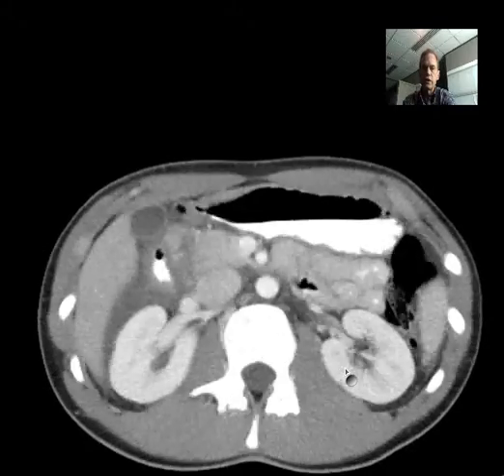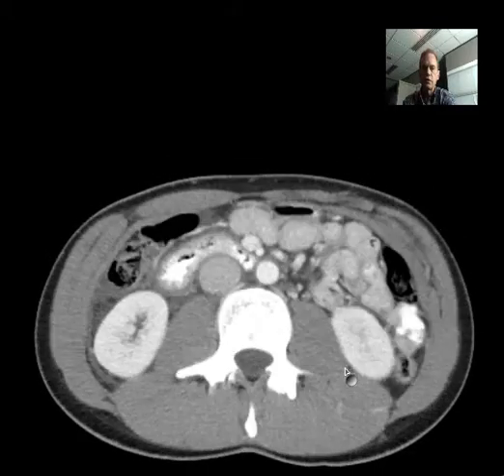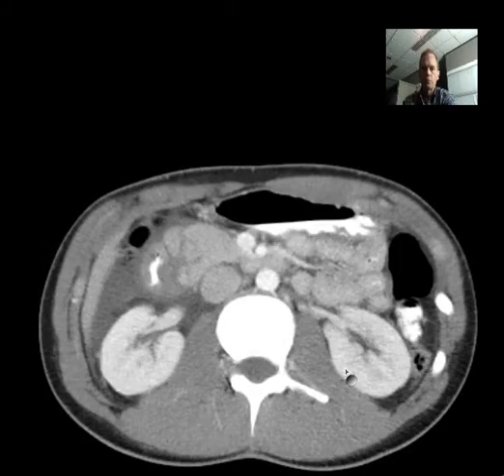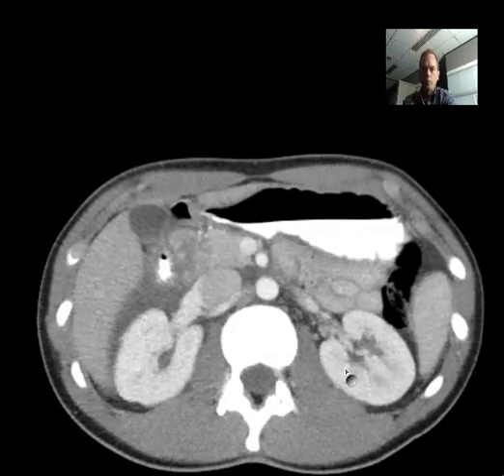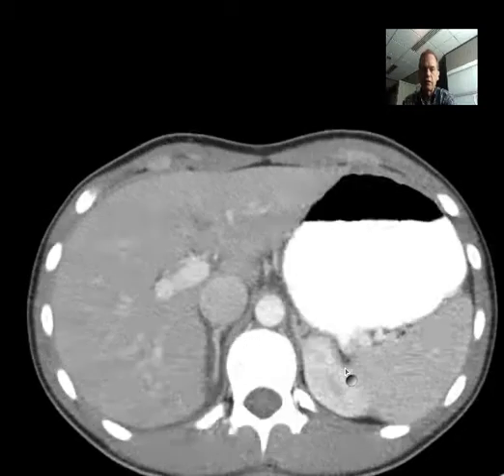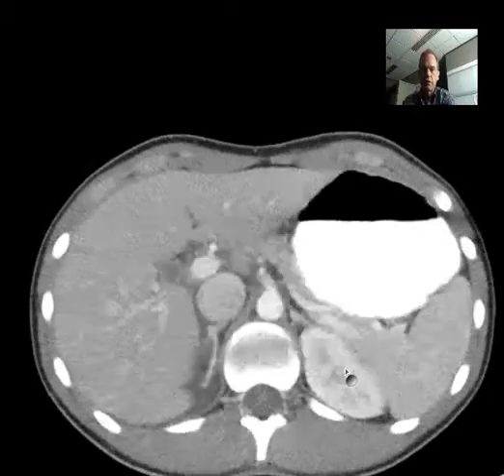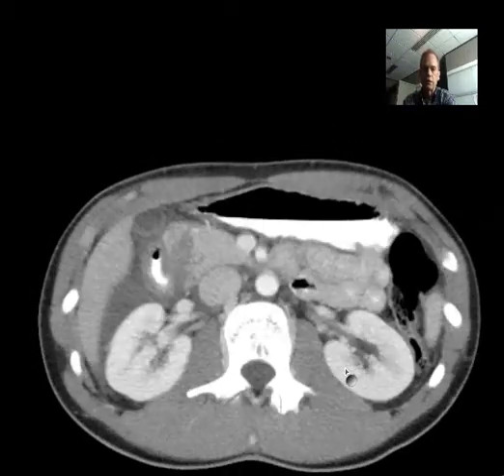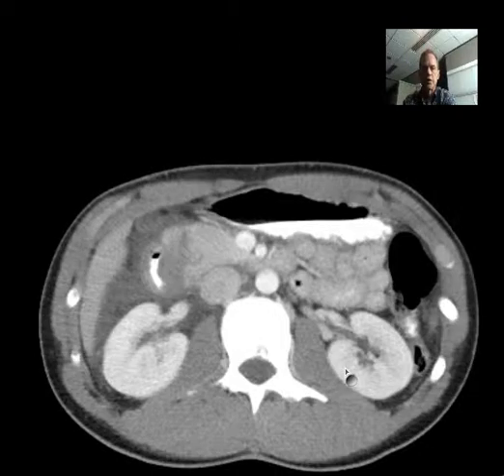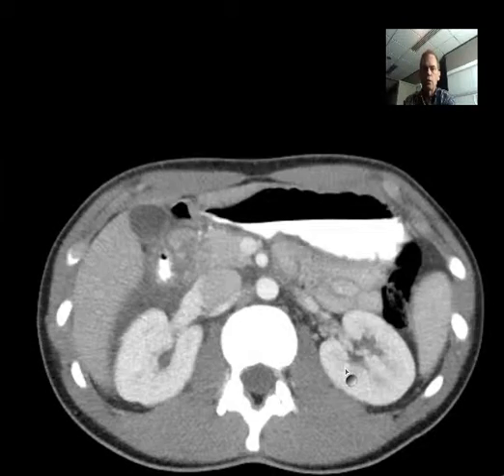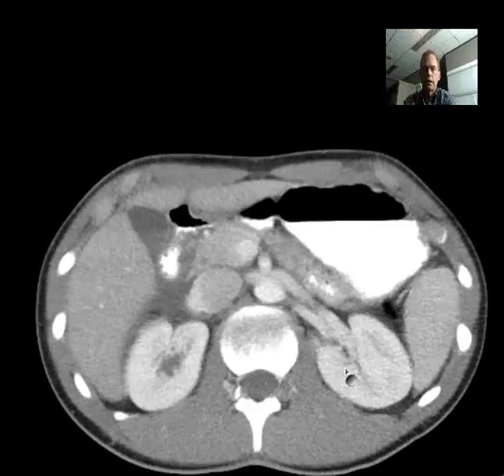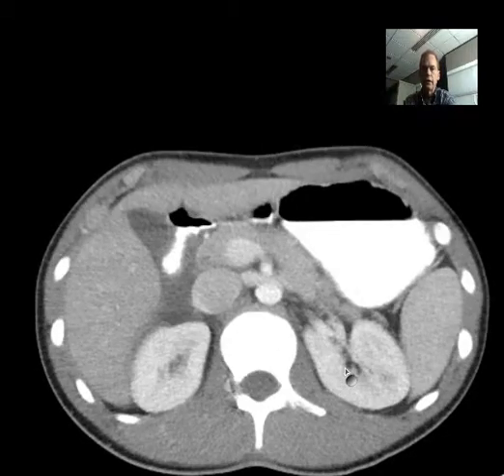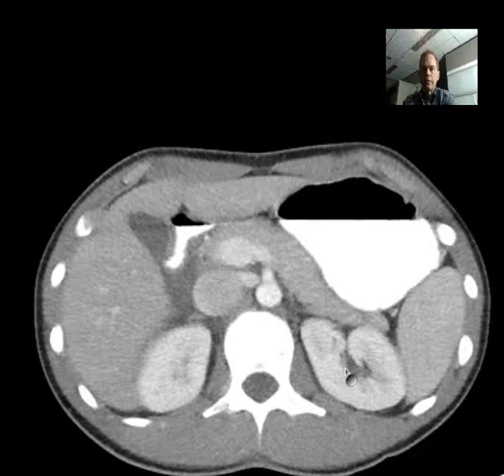Now look at the upper abdominal structures and get an idea if you see anything that looks abnormal. If you've identified the abnormality, good. The abnormality is right on this image, and it involves the pancreas.